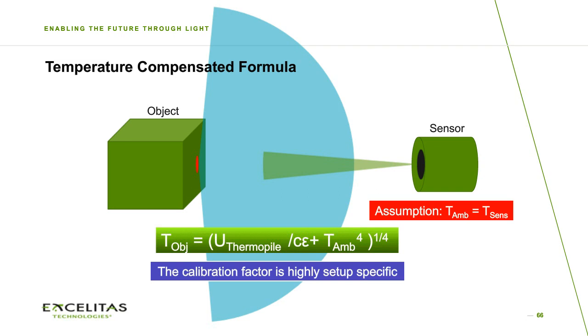Okay. Next, what is the furthest distance for a top-of-the-head temperature measurement from a ceiling-based sensor? For a ceiling-based sensor, you will not be able to measure the forehead. What you need is a direct sight on the forehead. There are actually two measurement spots which I am aware of that correlate nicely with the body core temperature.